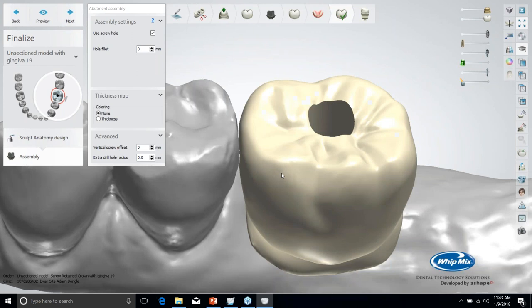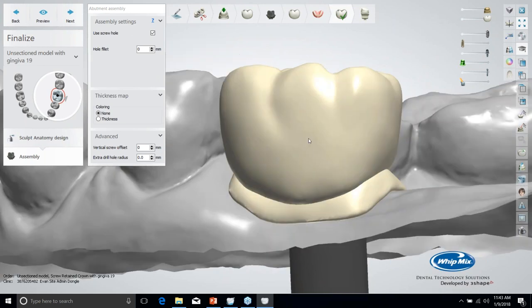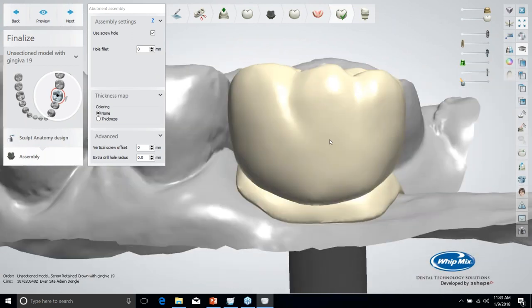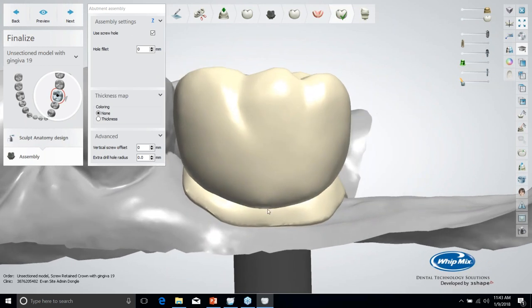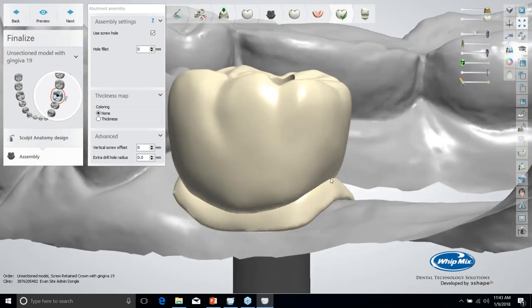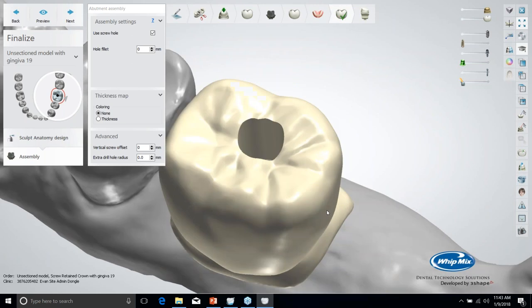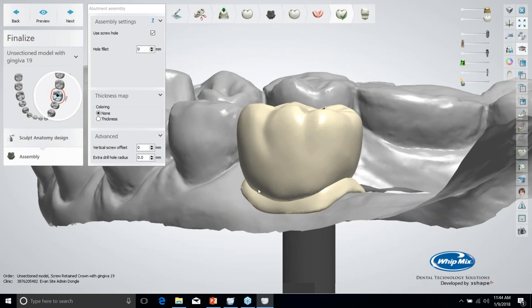One thing before we get out of the design that I didn't mention in the slides is that if you're going to be milling these zirconia top pieces in-house, then you need to have a five-axis mill. You can't do them on a four-axis unless you want to sit there and spend hours cleaning up this crown and tissue junction. And the reason you need five axis is when this unit goes in a puck, a traditional crown does not have this tissue. So anything that the tool can't reach from the occlusal side, it can reach from the gingival side.